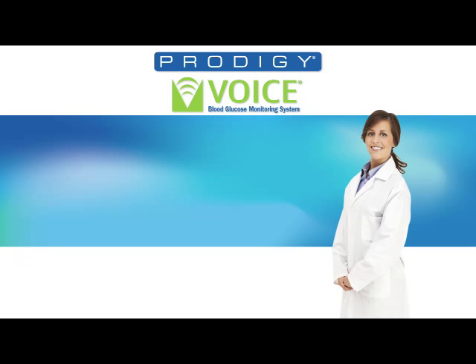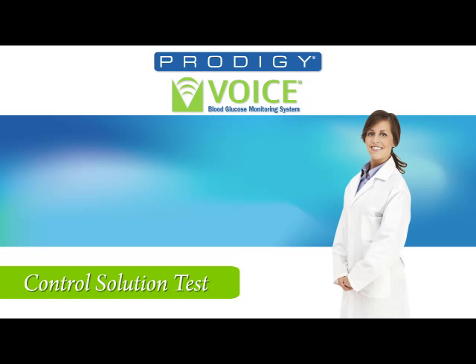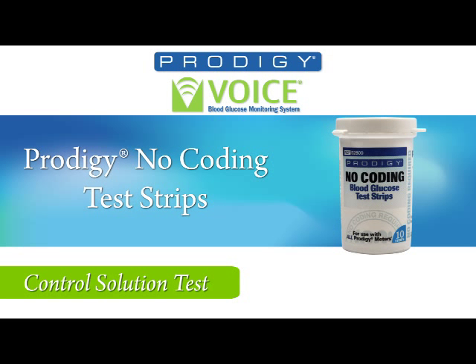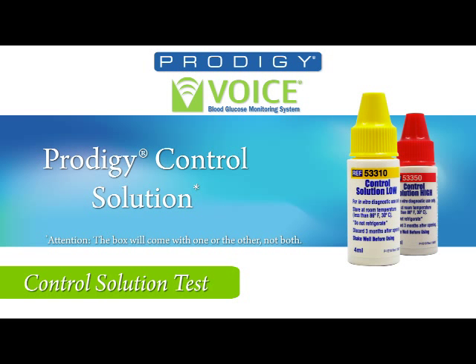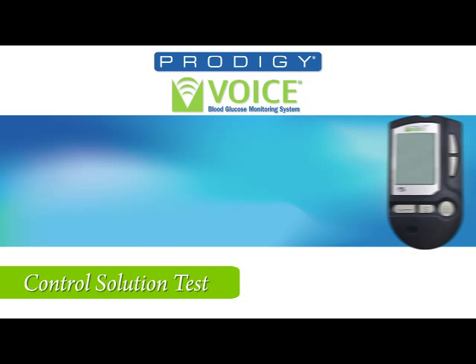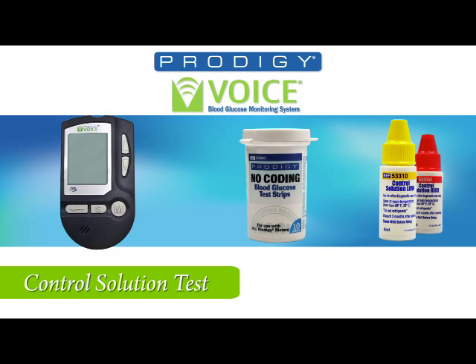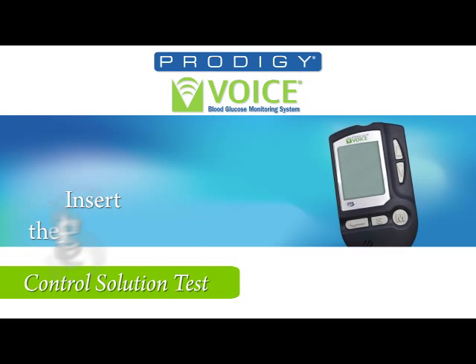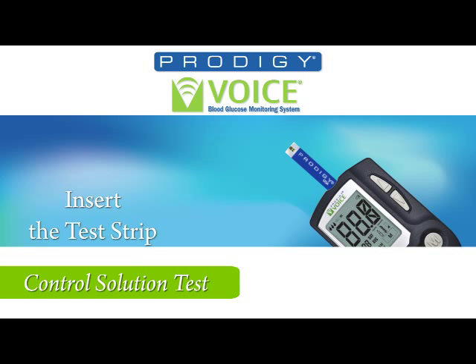You will need the following to perform a control solution test: the Prodigy Voice Meter, Prodigy No-Coating Test Strips, Prodigy Control Solution, and tissue. Remember, only use Prodigy control solution and Prodigy no-coating test strips with the meter. First, insert a test strip into the test strip slot.